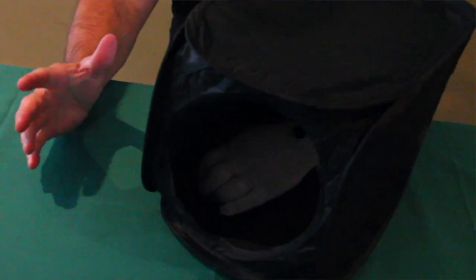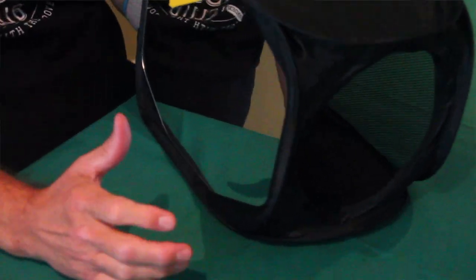And then, of course, think about mirror box therapy. Take the SaeboStim Micro, put it on, put the arm inside the box, and then have them actually do some mirror therapy exercise while receiving the stimulation. That's even better. There's some really good research regarding combination of sensory stimulation and mirror box therapy.